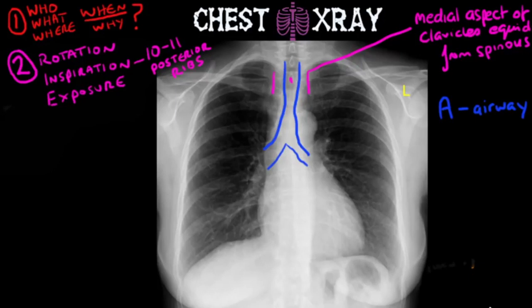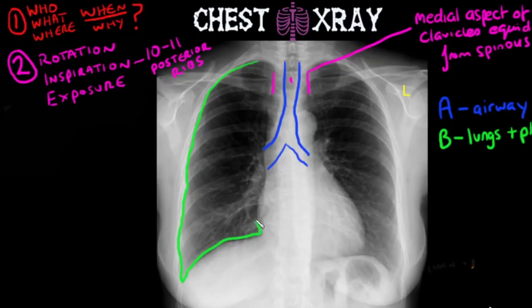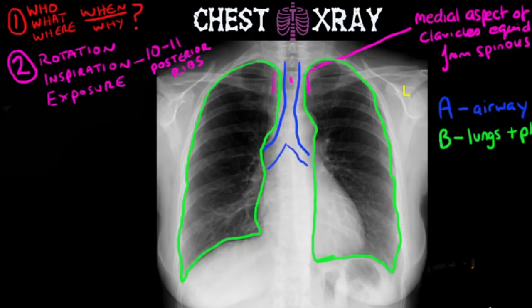Moving on to B: you are going to trace the lung fields and look at the pleural spaces as well. You are going to check that lung markings go all the way to the lateral aspect of the rib cage, and make sure there are no collections in the distal portions and no collapse of any lung segments. Compare each side and contrast — of course the patient can have bilateral pathology, but it is good to compare.